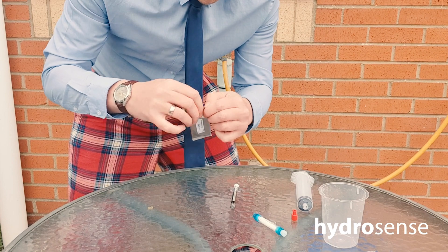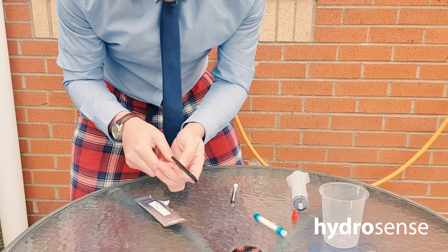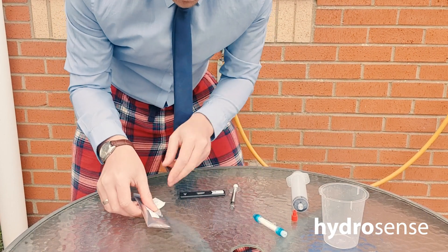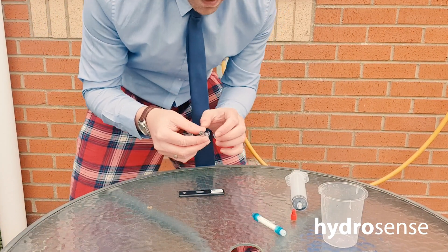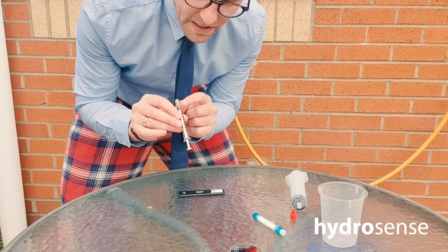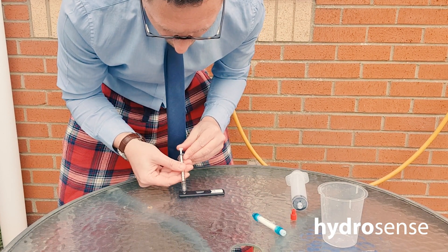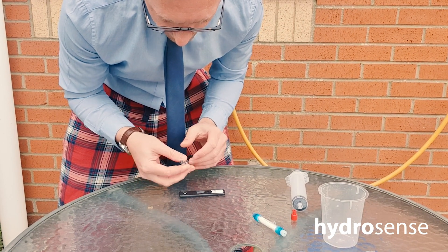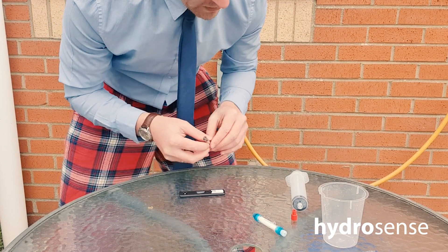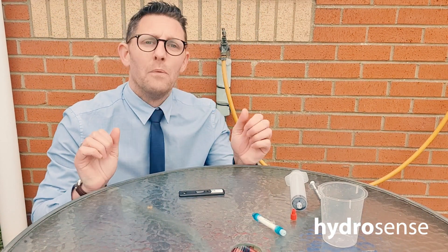Any Legionella that was in the filter is now in the buffer solution. Next, we take our HydroSense strip and lay it flat on the table. Then we apply that 0.1ml — one tenth of a millilitre — onto the first window of the HydroSense. All that solution is now on the first window, so now we have to wait 25 minutes and then we can get our result.